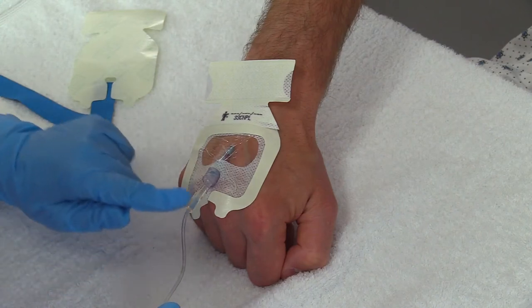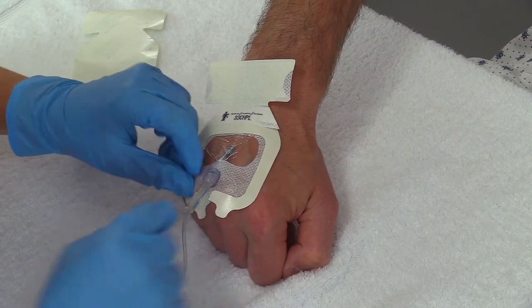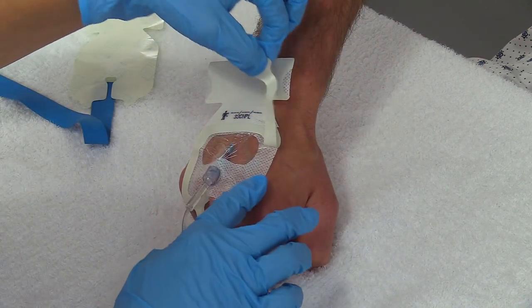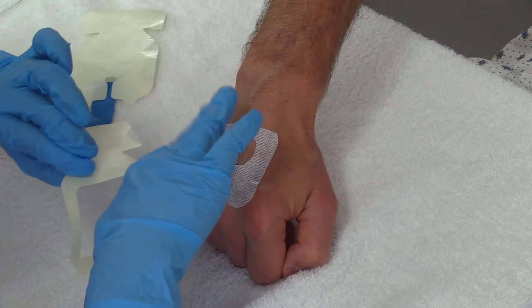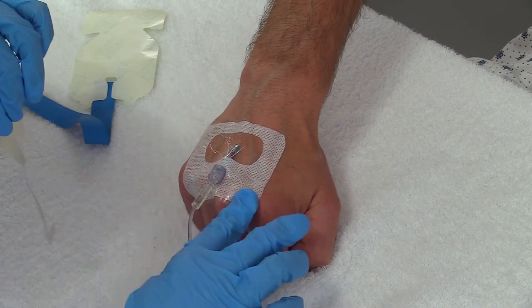Then I'm going to tear off these edges around the IV — these little edges right here. As you're doing that, just push it down and make sure it sticks to the skin, because you don't want to lose your IV after you have started it.